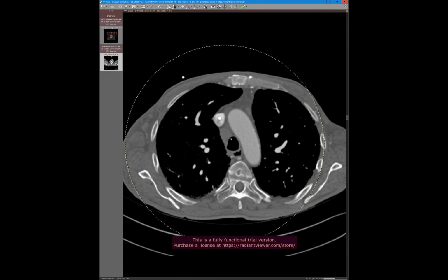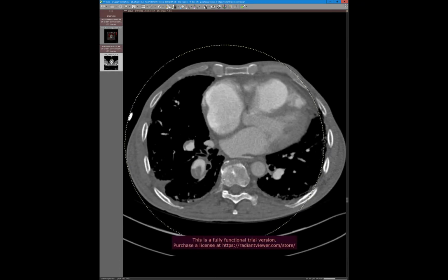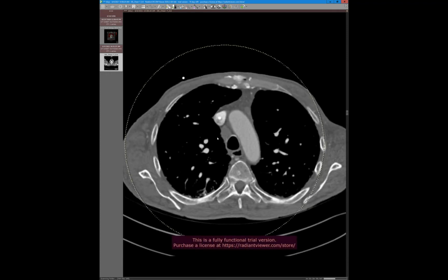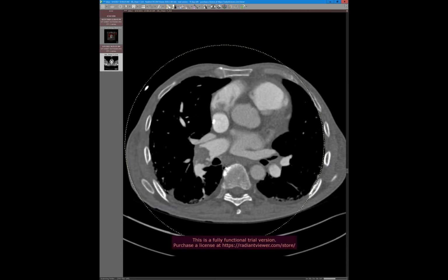For us, we look for other evidence of disease or clear areas of multiple occlusions distal to the layering thrombus. But I think this is something I struggle with, and we all struggle with. But in terms of our guys, they seem pretty confident about it quite frequently.